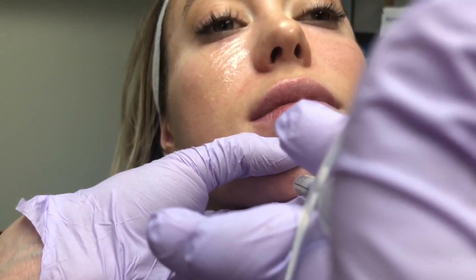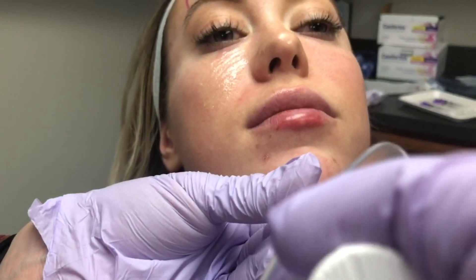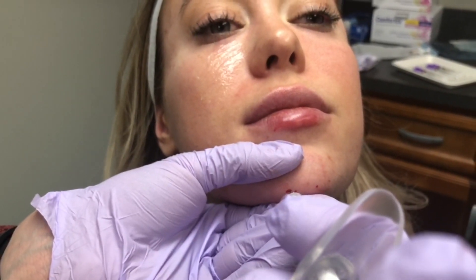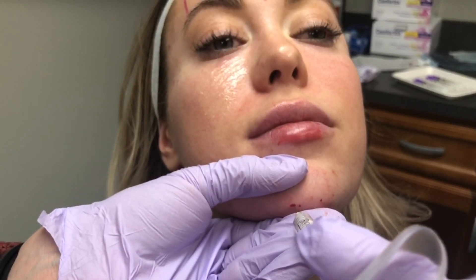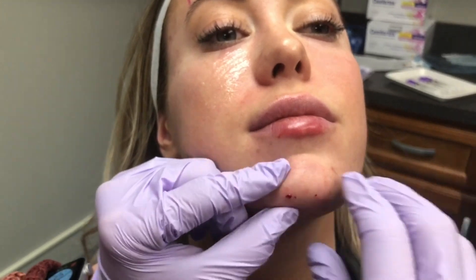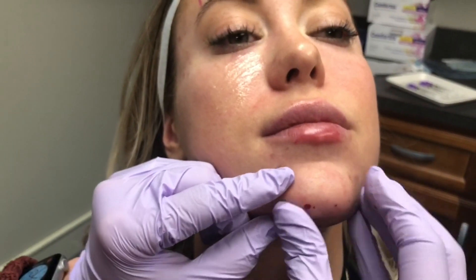Allowing you to be the most diverse injector and really offer everything your patients are looking for — right now that chiseled jawline and sharp chin are just really what people are going for. You want to be able to offer all of those services so that your patients keep coming back to you. It looks like Megan decided to go in for one more injection here. The patient did have a preexisting lump under her chin from previous chin filler placed elsewhere, so she's placing a little bit of additional product just to try and disguise that appearance.